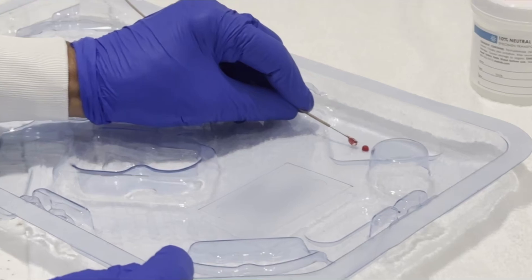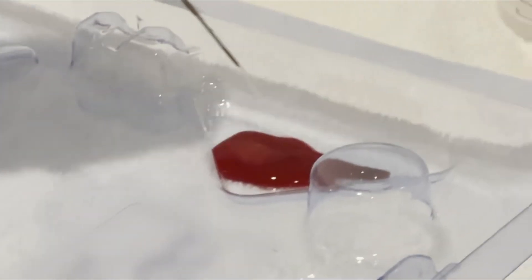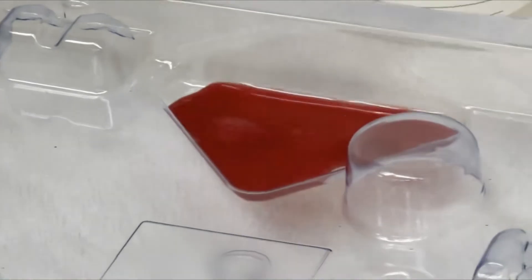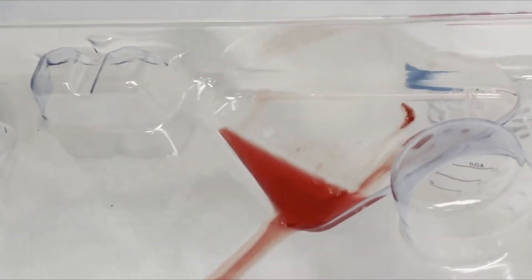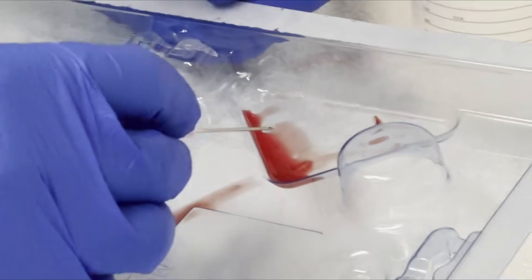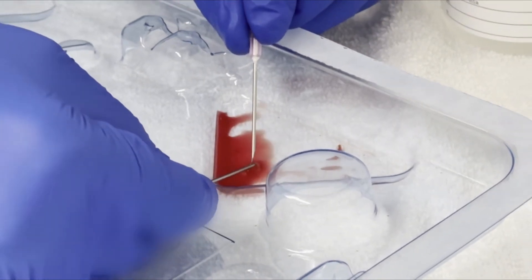We then attach a 10 cc saline flush syringe to the inlet of the 19-gauge needle to express the liver biopsy specimen out of the needle onto a plastic tray. We tip the tray to drain the excess fluid so that we can better identify the individual pieces. Using a needle, we separate the blood clots from the specimen and place the specimen into a cassette that is lined with filter paper.